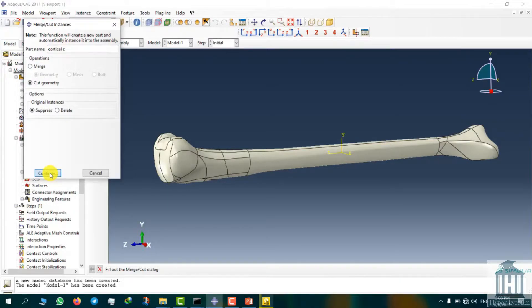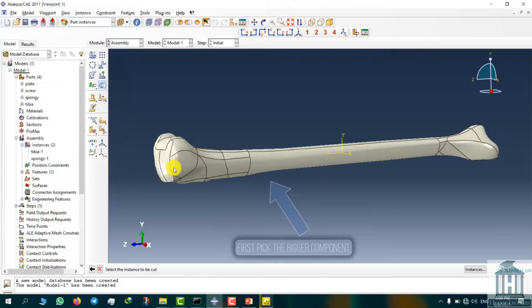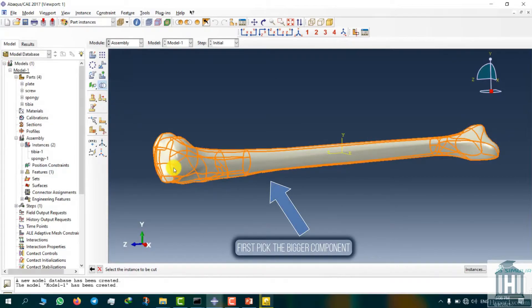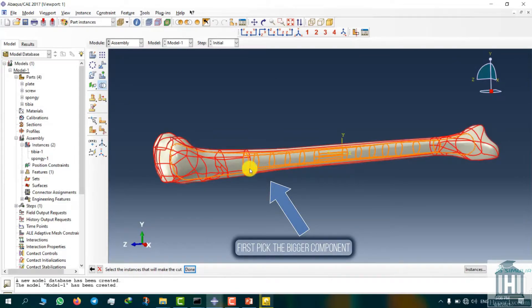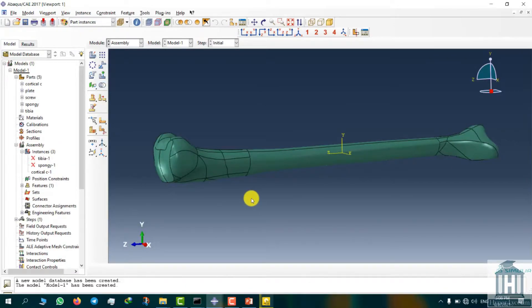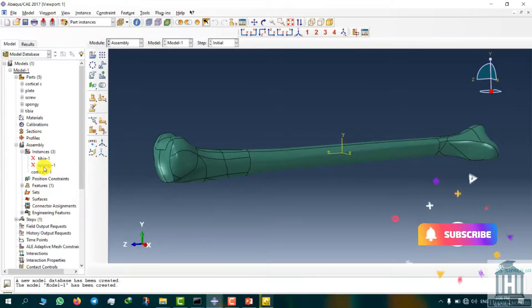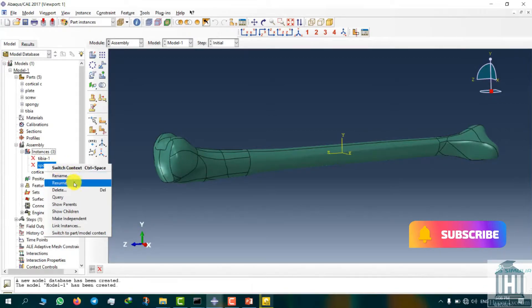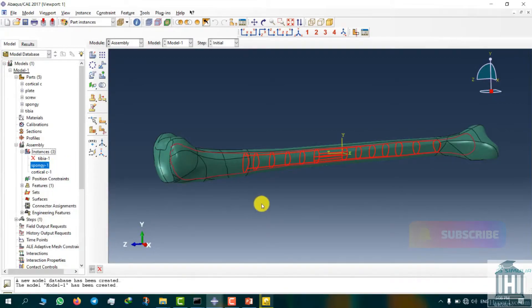Select cut geometry in the operations field and make sure that the suppress option is checked. Now we need to select the bigger component which we want to extract from. Then choose the smaller component that is intended to be extracted. After Abacus creates the hole inside the bigger component, which is our spongy bone, resume the spongy bone instance from the left menu.